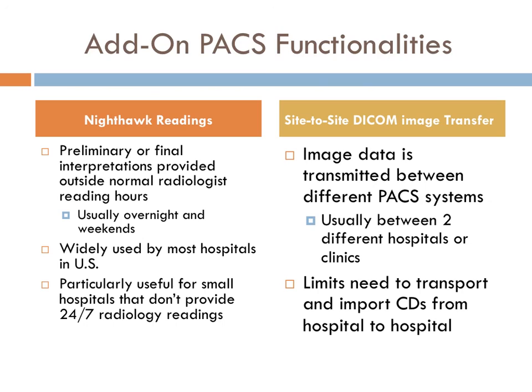Then there is site-to-site DICOM image transfer. This is image data that is transmitted between different PACS systems, and it's usually between two different hospitals or clinics. So if you have an organization and you have hospital A that has 3 different subsidiaries of it, clinic A, B, and C, data transmission you want to occur between all 4 of those sites.